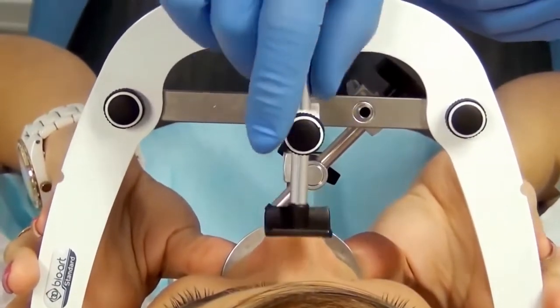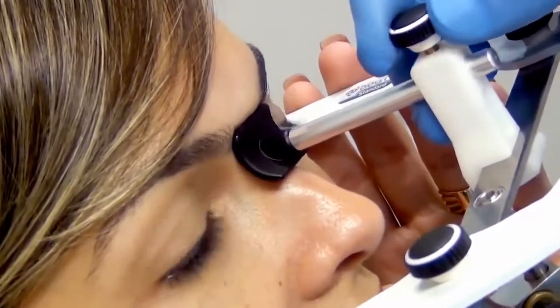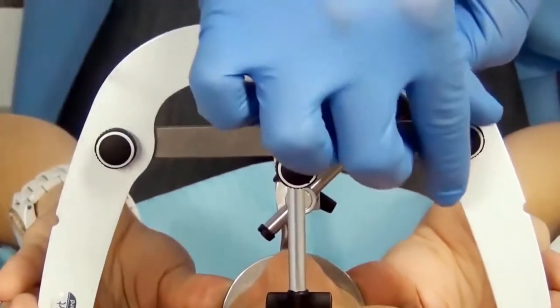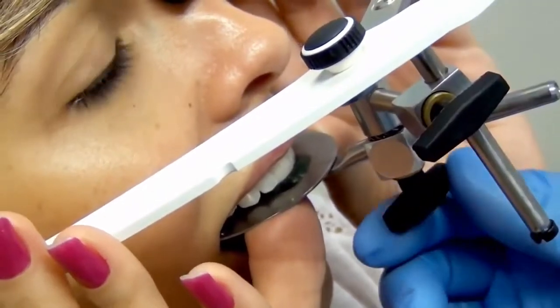Support the nasion relator on the patient's glabella and tighten its screw, followed by the three set screws of the standard face bow. Once the nasion relator and the face bow are positioned, tighten the wing screws of the fork.